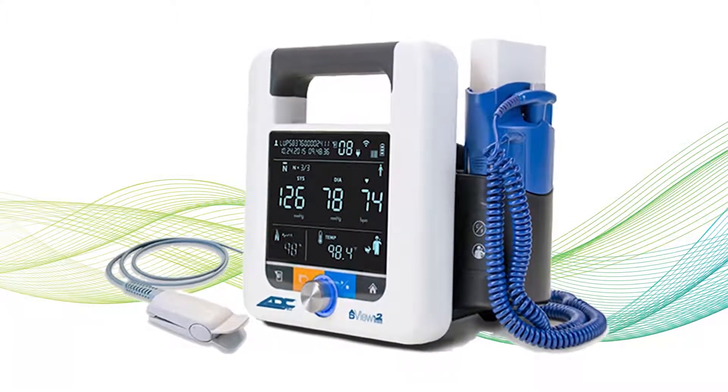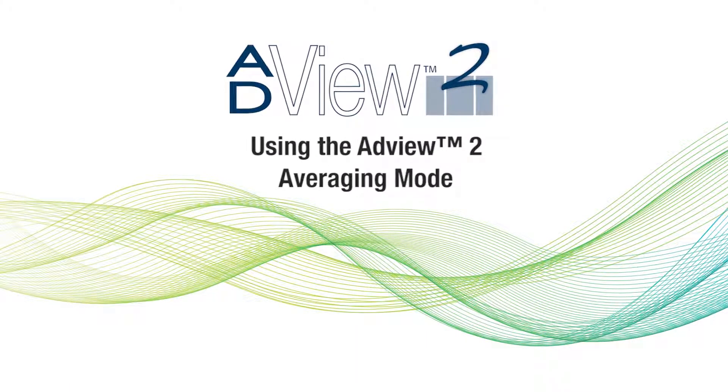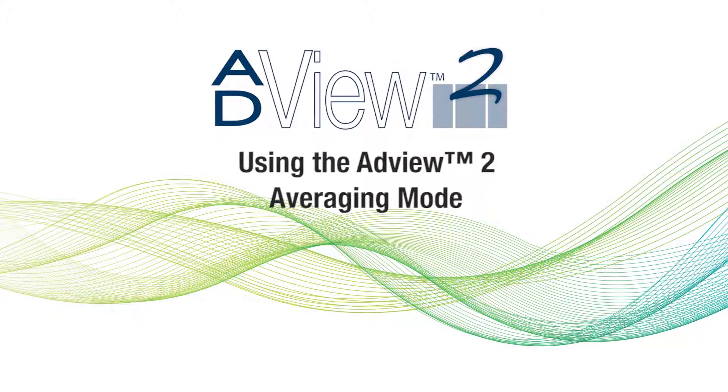Welcome to ADC's series of instructional videos for the ADView 2 Modular Diagnostic Station. In this video, we'll show you how to use average mode to take and average a consecutive series of blood pressure measurements.